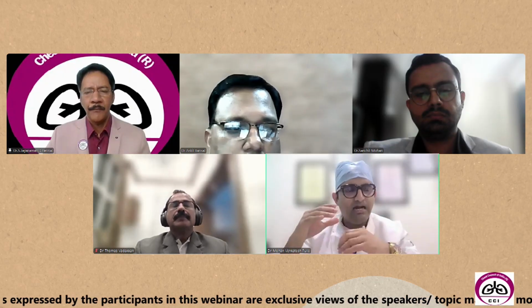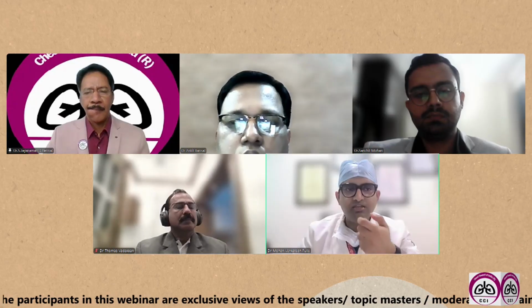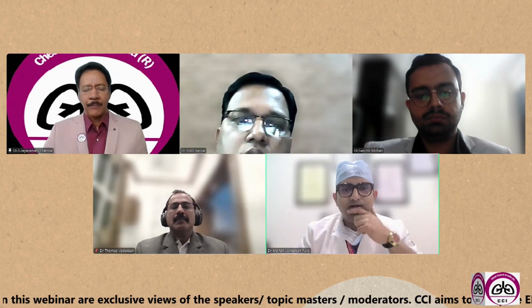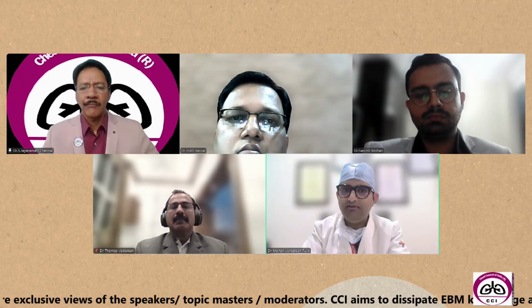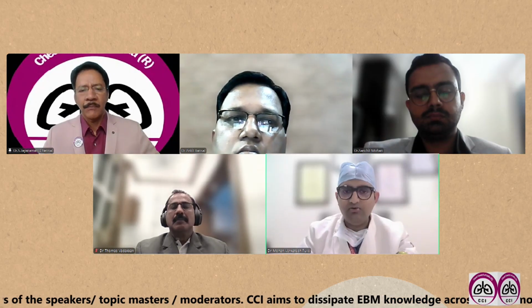So this is one tricky situation where mediastinoscopy can actually prove such lymph nodes when there is clinical suspicion. And the second important thing is if there is a lymph node station which is not accessible by the EBUS or the EUS. Most of the lymph nodes are possible except maybe level 5 and level 6 lymph nodes, which are not accessible by conventional EBUS or EUS.